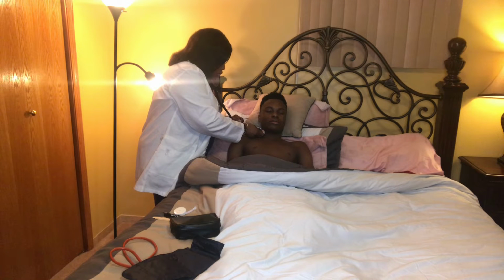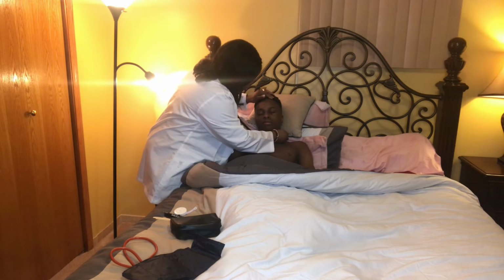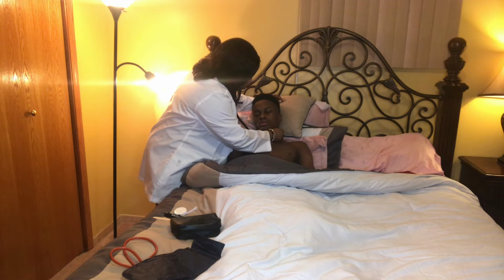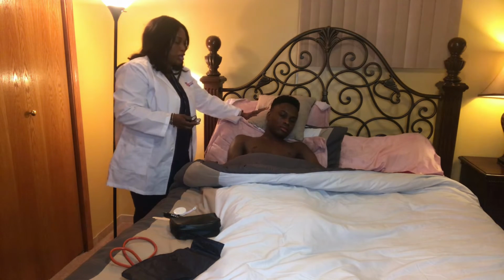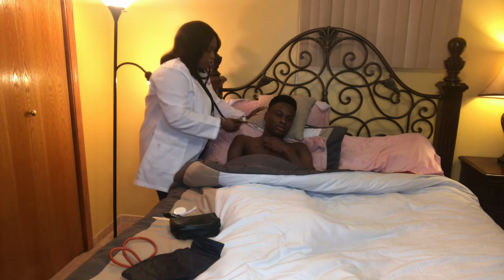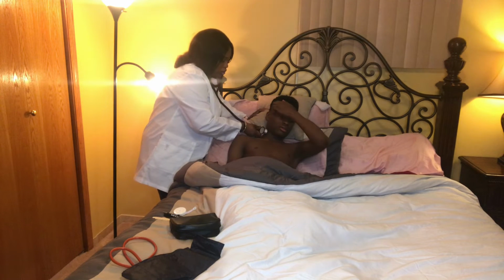As I'm listening to the carotid pulse, I want to listen for bruits, and I'm checking the left side as well. I'm checking for bruits, and there's no bruit. I did not hear a bruit, I just hear a swish sound. And I'm going to use the bell side also to listen.